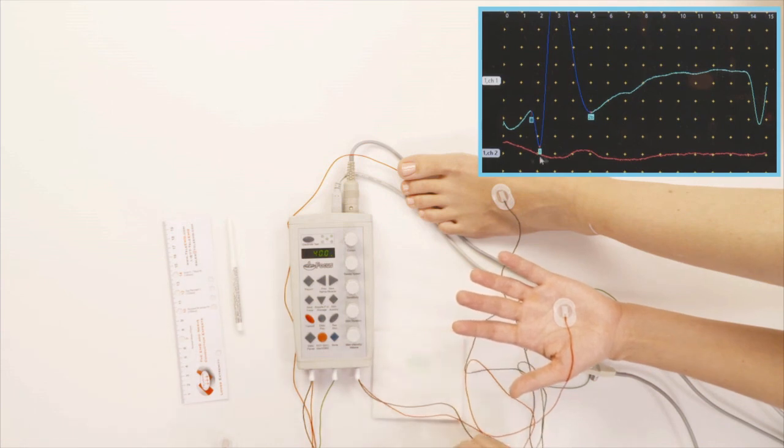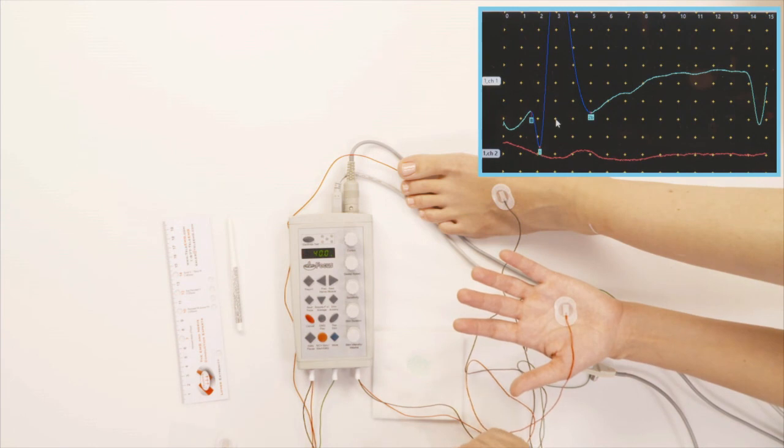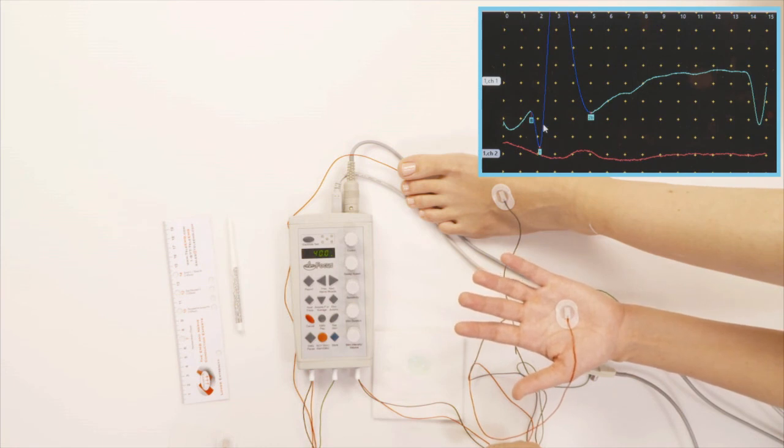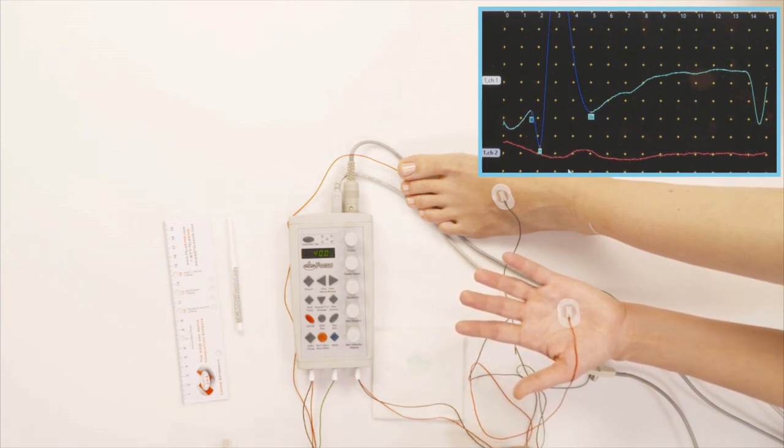And as you can see here, the hand has a much better response than the foot, because when you have a neuropathy, when you have an injured nerve or a diseased nerve, the hand is involved much later than the foot is. So the hand response is much greater than the foot response and also occurs earlier than the foot response. And that's the galvanic skin response.